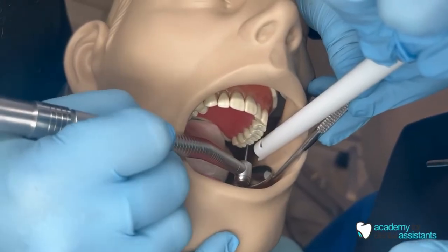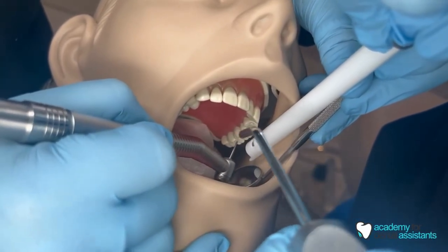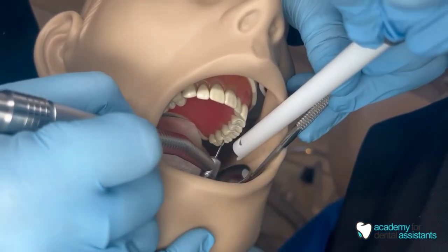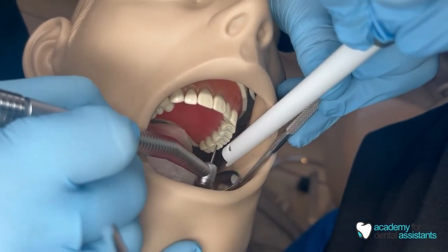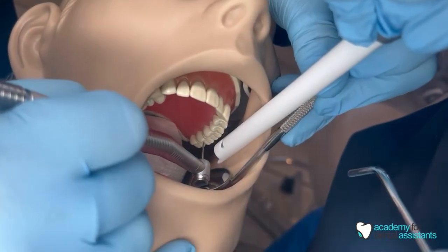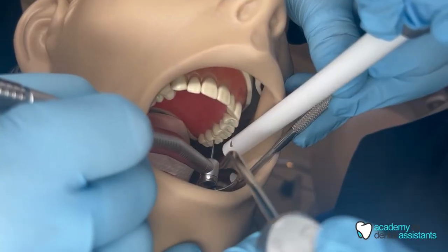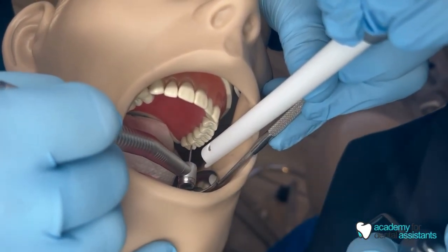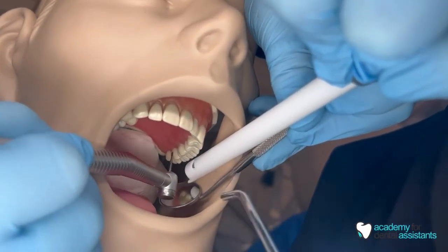Now the doctor is working on tooth number 15. This is actually the hardest tooth or the hardest area for dental assistants, since there's very little room and it's very hard to see from the patient's left side. We're going to use the HVE to retract the patient's cheek. The doctor will be working on the occlusal of number 15, and we want to make sure we always have something in our left hand as well — an air-water syringe to blow air on the mirror in case it gets foggy.